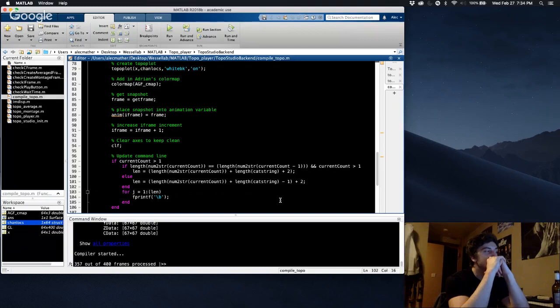Almost there. It's gonna take 11 days to save once we're done processing everything.